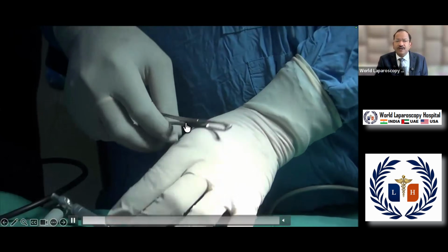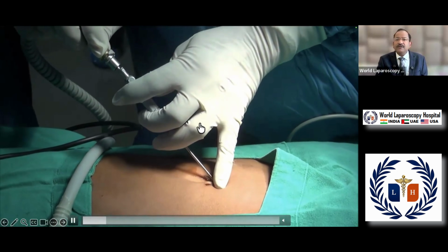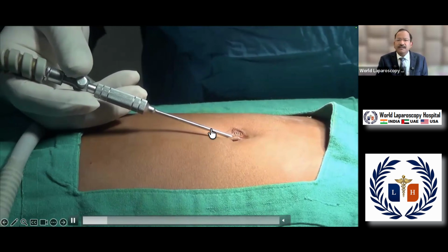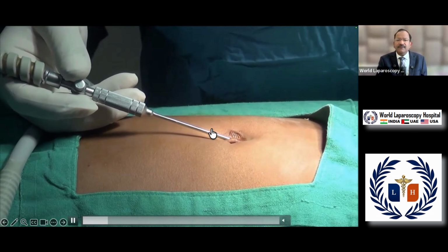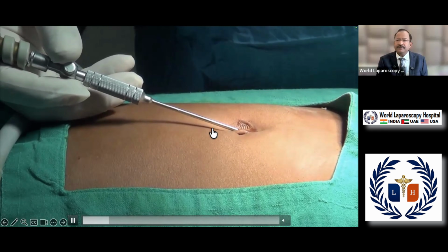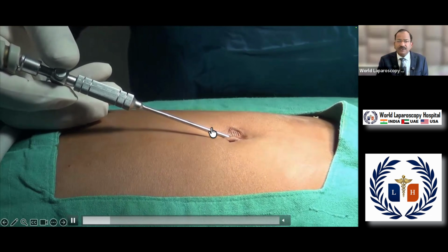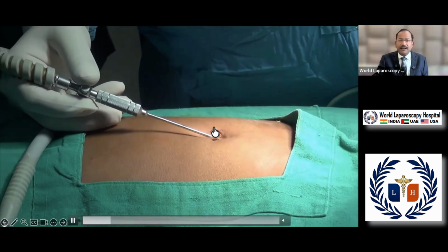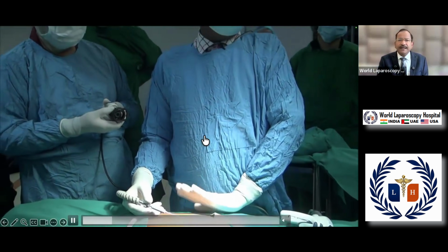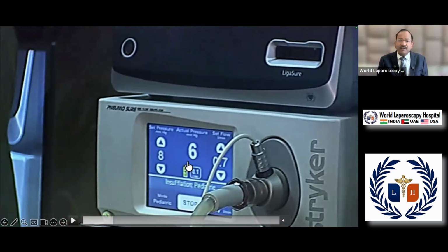After that you attach the tubing of the insufflator and start the flow. Once the flow is started, you should look at the insufflator. Your eye should be over the insufflator. And on the insufflator, what will you look for? You will look for the quadromanometric indicator. Remember, we will discuss the insufflator also once we have the insufflator class. Every insufflator has a quadromanometric indicator, and your eye is looking at the insufflator. And this is the quadromanometric indicator.